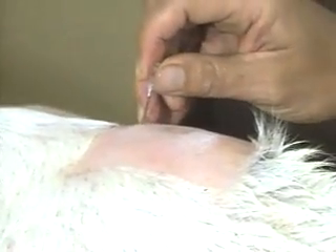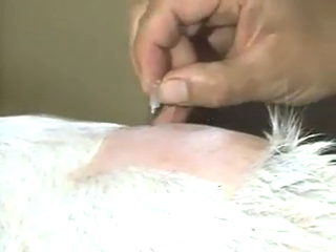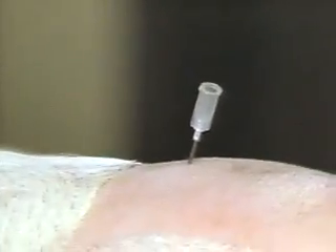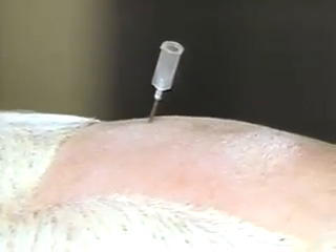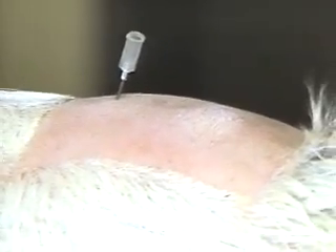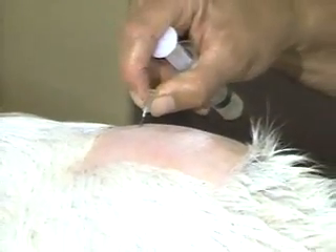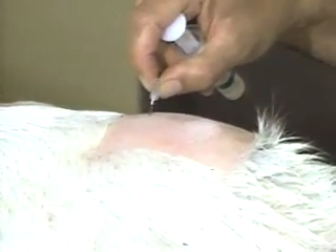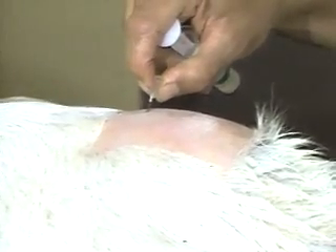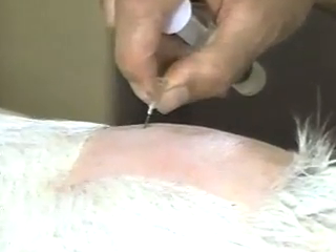Most cattle make a slight movement at that point. If you have some question about the disposition of the animal, it would be best to stand off to the side or kind of in a frontward position so that she doesn't kick you. You can see that approximately one inch of that needle is buried. I felt that it went through some ligamentous tissue, and now it's resting just onto bony tissue.